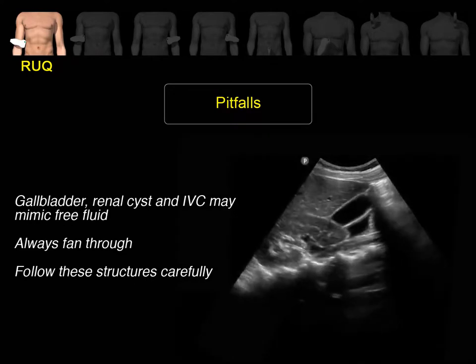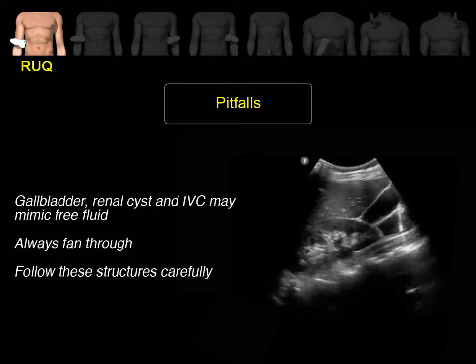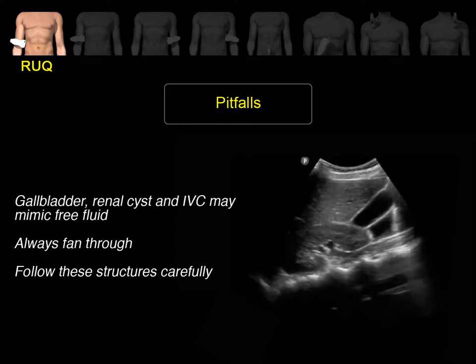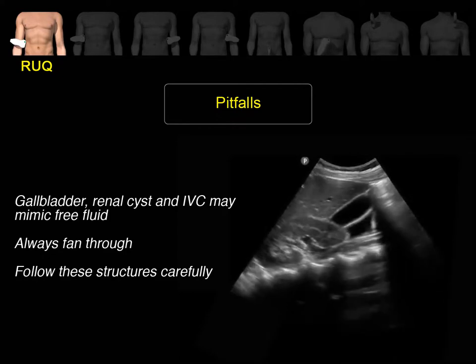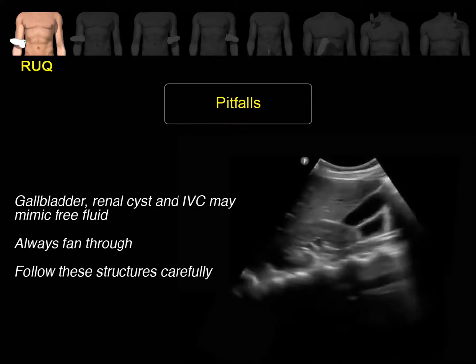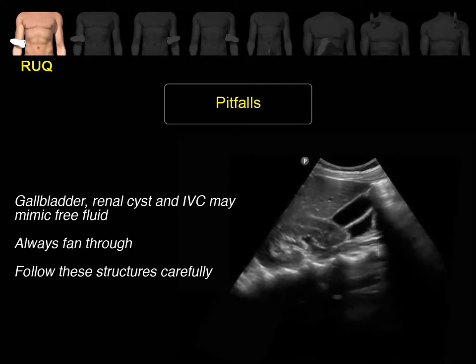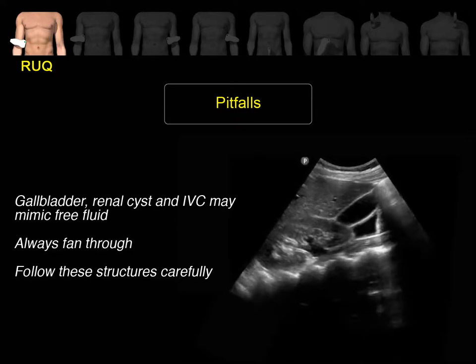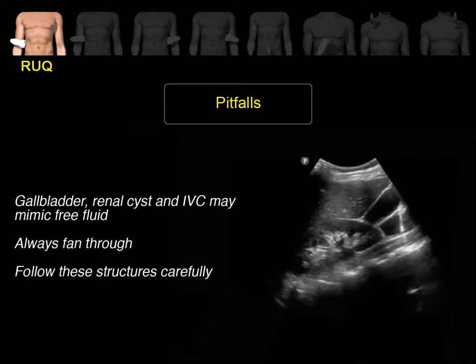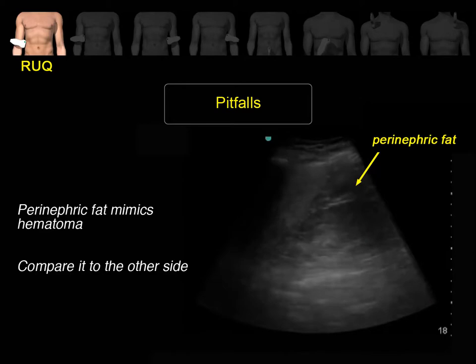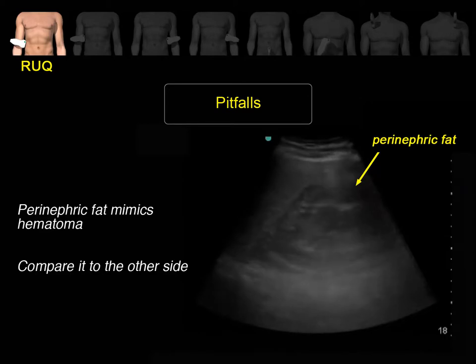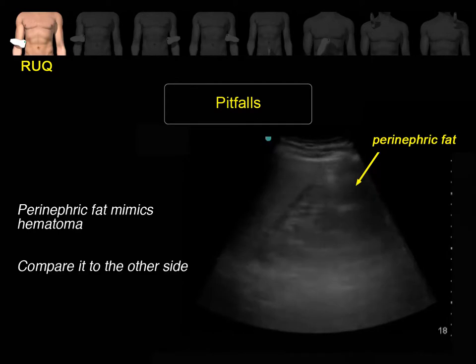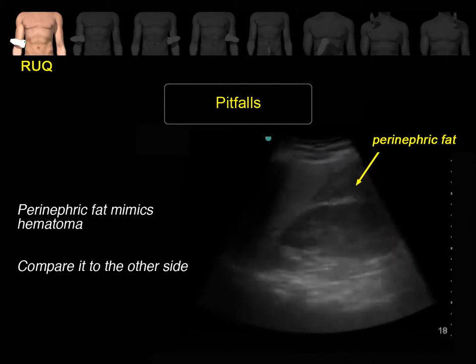Fluid-filled structures such as gallbladder, renal cysts, and IVC may look similar to free fluid. Always fan from one end to another and follow these structures carefully. Free fluid appears pointy, in contrast to other rounded structures. Perinephric fat mimics hematoma, but this fat has some echogenicity and correlates with fat tissues in other areas of the body.